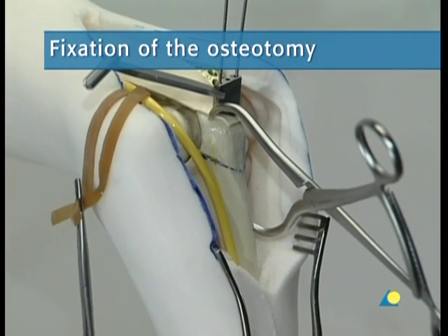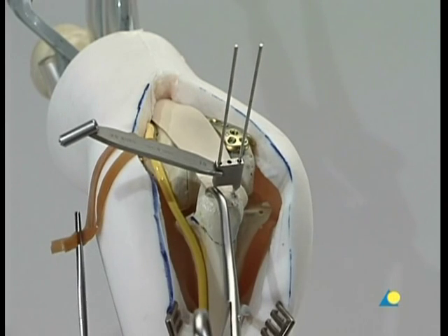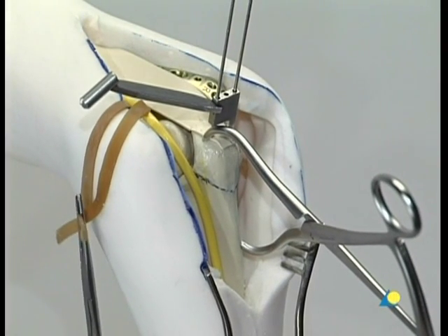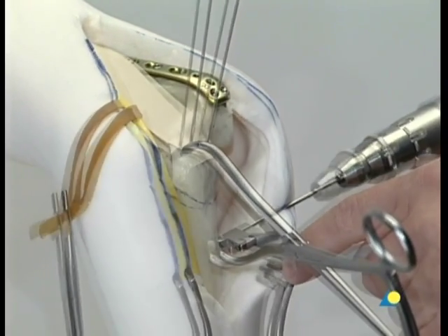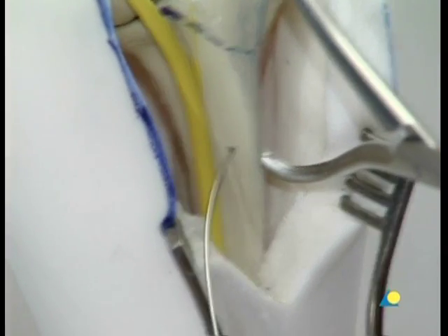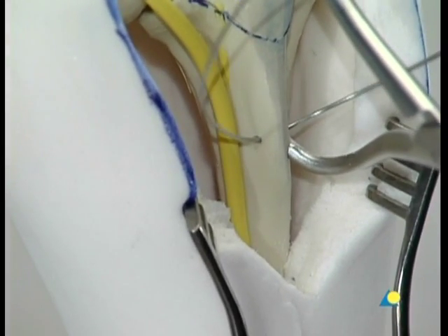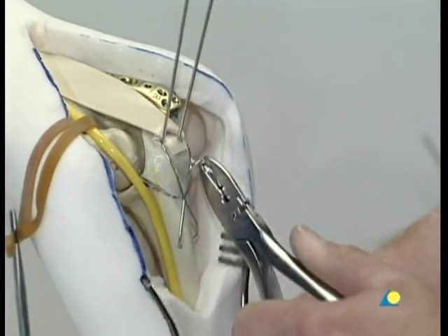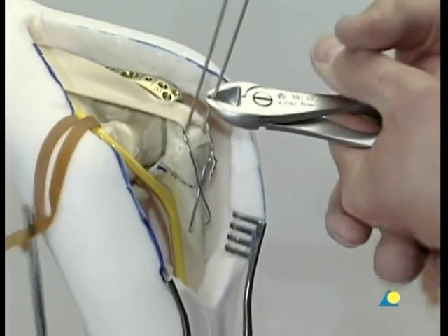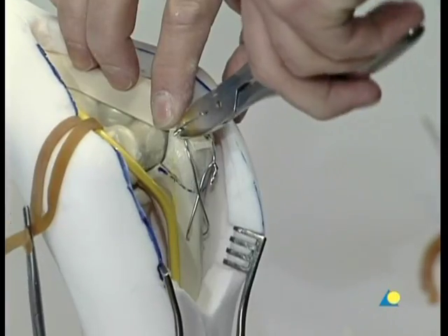The olecranon is reduced and secured with the pointed reduction forceps. Two 1.6 mm K-wires are inserted parallel to each other through the olecranon into the ulna. A transverse 2 mm hole is drilled into the ulna, 2 centimeters distal to the osteotomy, and a piece of cerclage wire 1 mm in diameter is pushed through the hole. The figure-of-8 wire loop is fastened and tightened while the elbow is in slight extension. The K-wires are cut, bent, and completely sunk into the olecranon.